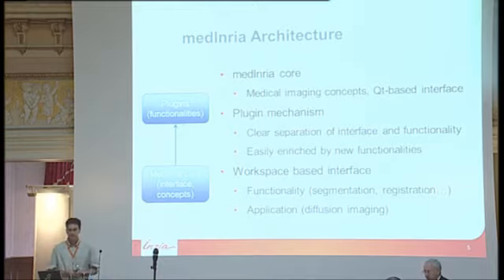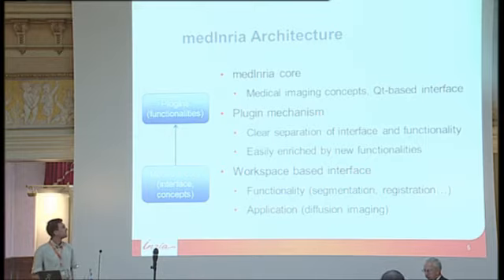Then the second layer of the software is the plugins, and really the plugins are here to bring the functionalities. So there is really a clear separation between the interface of the software and the functionalities. And so the application gains from this because it's easily enriched by new functionalities. You just have to call a plugin to bring a new functionality.